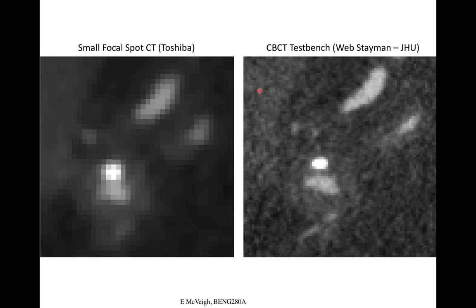So it's the statistics of sampling, and it turns out that the generation of the x-rays goes as a statistical process, which is governed by a Poisson distribution. And the detection of the x-rays is also a statistical process that's a Poisson distribution. So if I try to generate 10,000 x-rays with my x-ray tube and I set everything up perfectly, my mA and everything, and say that should give me 10,000 x-rays coming out of there, you'll get 10,000 plus or minus every time, because the process itself isn't deterministic. It's a statistical process.